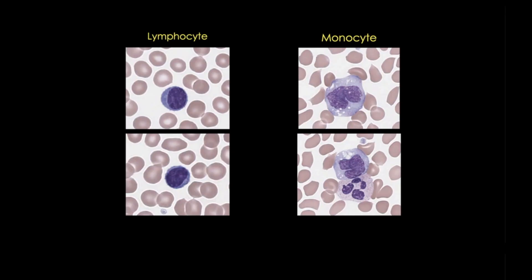Lymphocytes and monocytes are both agranulocytes. This means there aren't any specific cytoplasmic granules, color, or nuclear lobation that can really help facilitate the distinction of cells. However, the shape of the nucleus and the nuclear-to-cytoplasmic ratio, as well as specific features in the cytoplasm, can all be clues to differentiate between these two white blood cells.